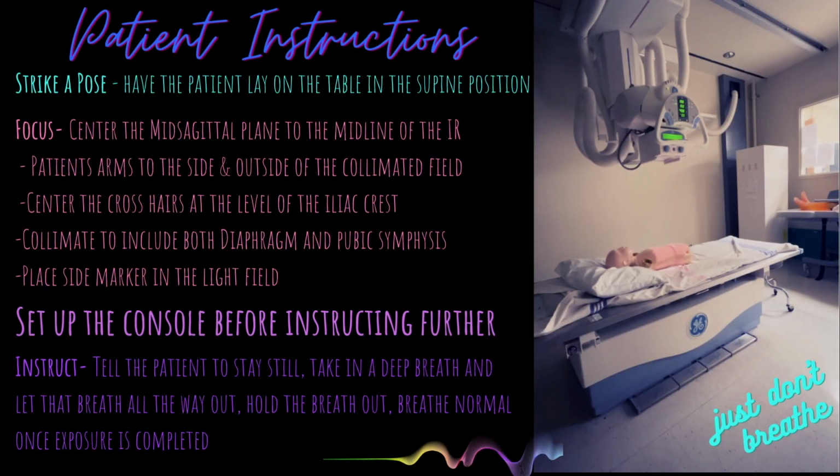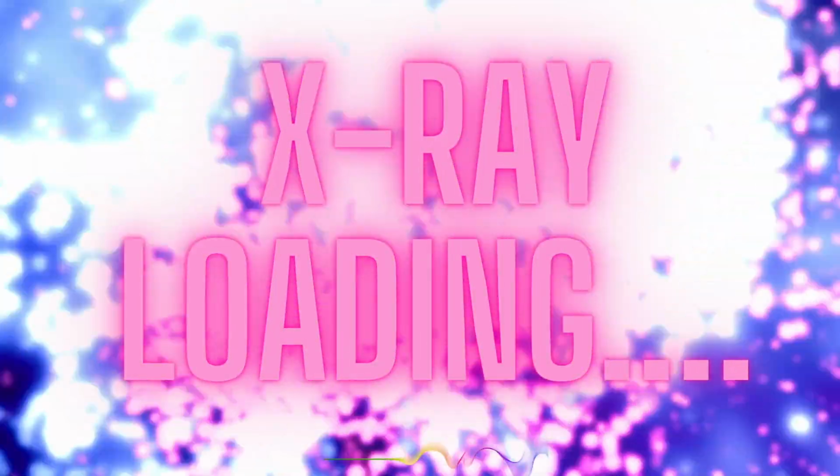Instruct the patient to stay still during the exposure. Explain that they will need to take in a deep breath in and let that breath all the way out and hold it out until instructed to breathe normally again. Now we wait for our exposure to complete.